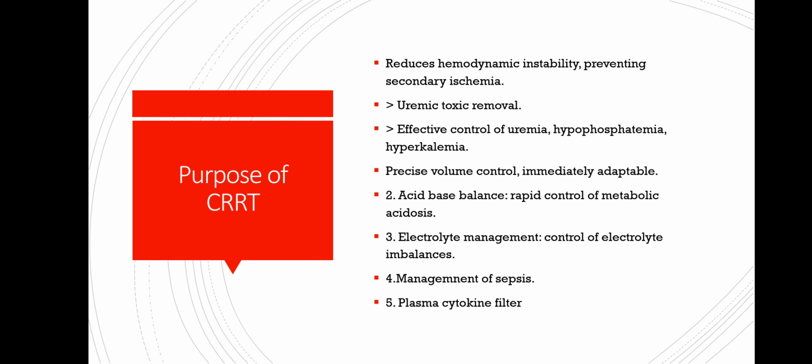Then the purpose of CRRT: it reduces hemodynamic instability and prevents secondary ischemia. It gives greater uremic toxin removal and effective control of uremia, hypophosphatemia and hyperkalemia. It provides volume control and is immediately adaptable.